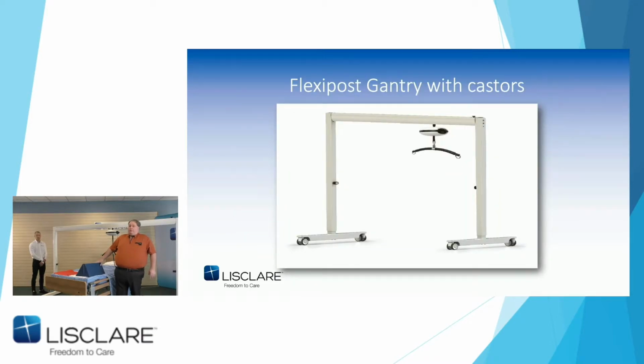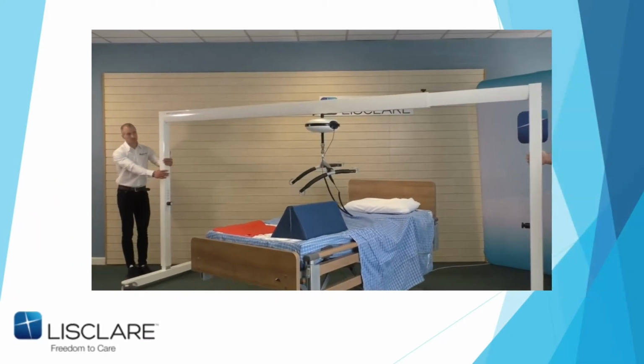So I would like to explain the choice of product. Firstly, as I say, we're an independent company, so we have a choice of what we use. So we decide what's best, I think, for the job. I've always wanted a gantry like this. It has easy adjusting length, and John's now going to show you this quickly because he's going to pull it out. This is the 3 meter, and it goes out to 4 meters.